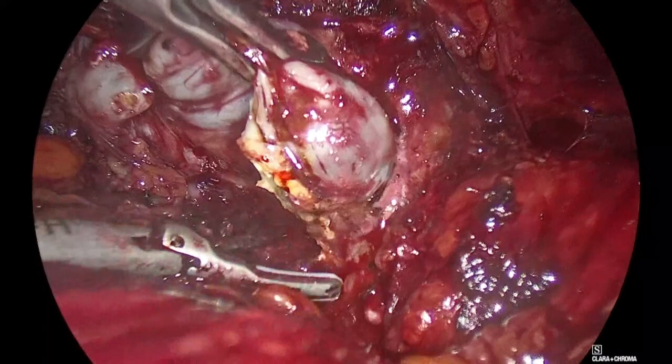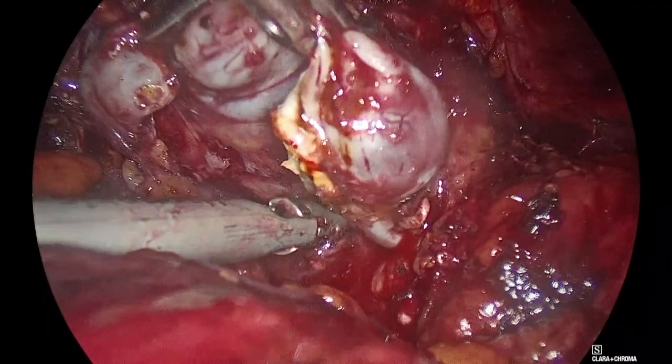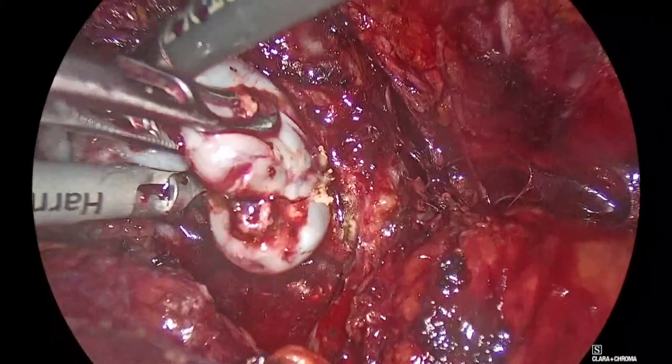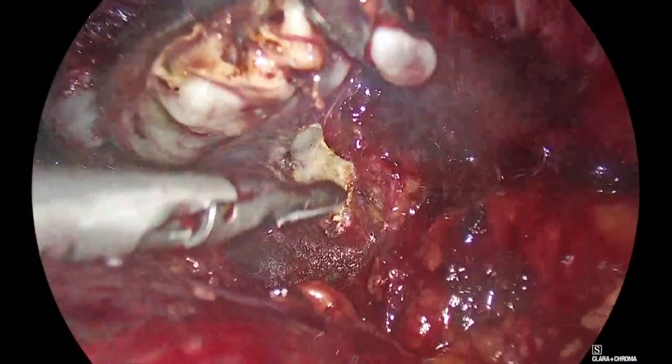Do you ever have any problems with the peritoneum becoming distended with gas? I put a green anesthesiology IV tube inside, so the gas can actually circulate. Goes in and out. I do that in most cases, as I did yesterday with my transperitoneal case for smoke evacuation. In this case, I use it so there is a circulation of the air, and I don't lose my space. So good, this is one side.